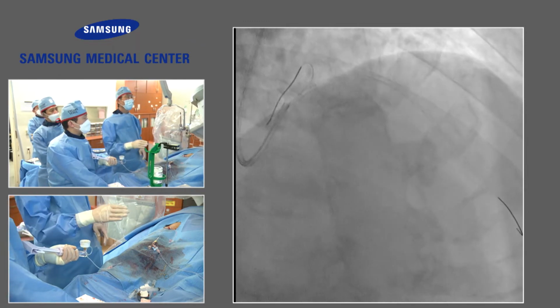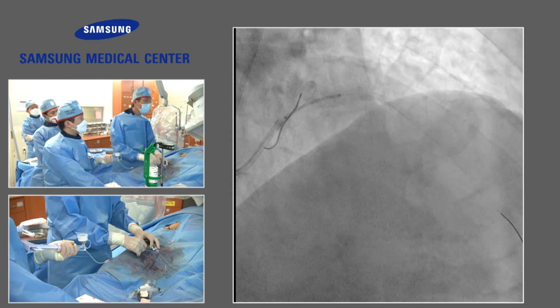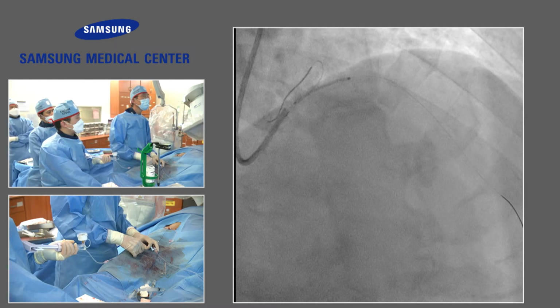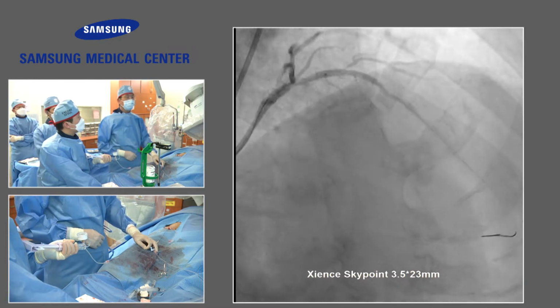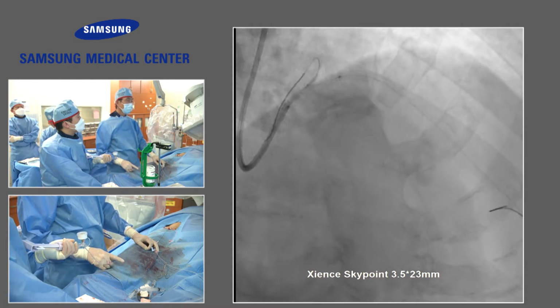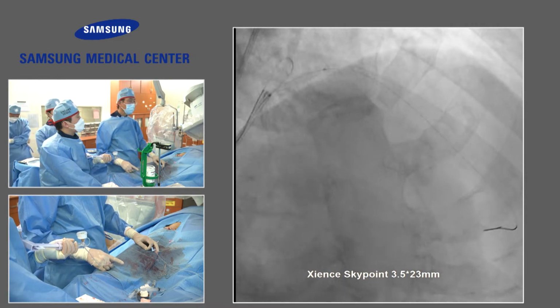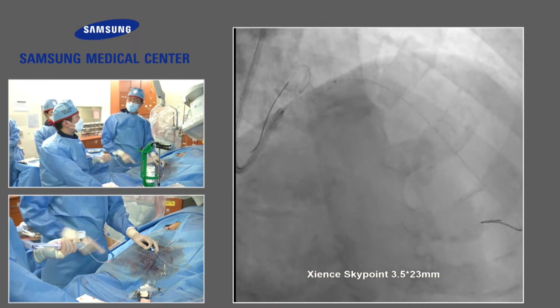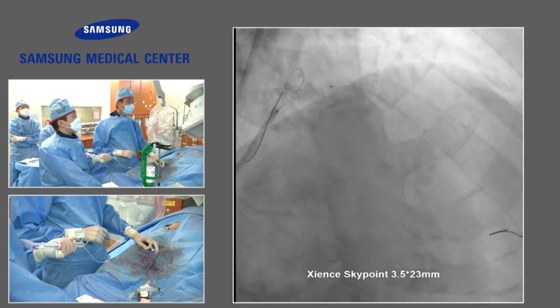If aggressive dilation with the diagonal compromises the LAD stent, that will be the problem. No, I do not comment about the diagonal branch. I think the diagonal branch is okay, but the LAD? LAD, yes. As I showed in the angiogram, just distal to the diagonal branch, it is a little bit narrowed, caused by the severe calcium in the mid LAD. And just look above the septal branch, the vessel size and the more distal LAD. So you mean that the stent portion is a little bit under-expanded.